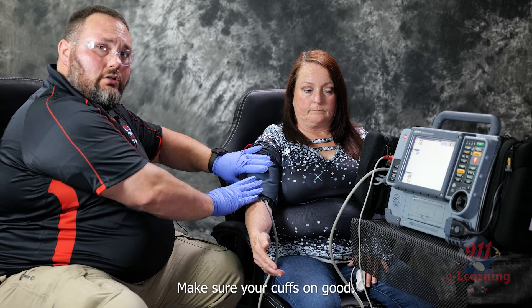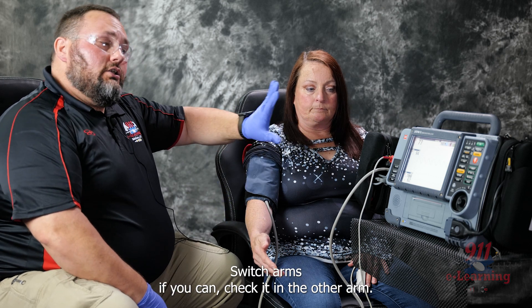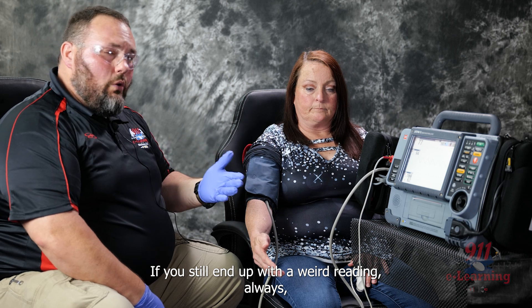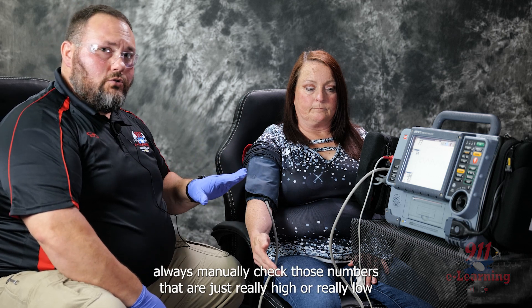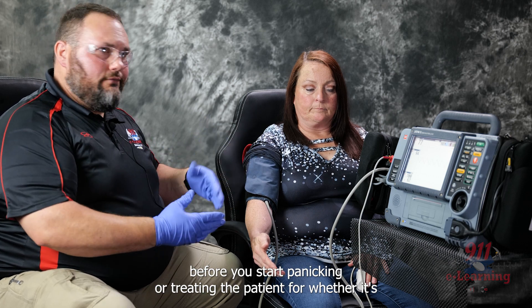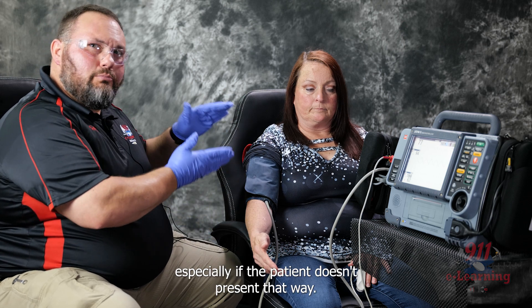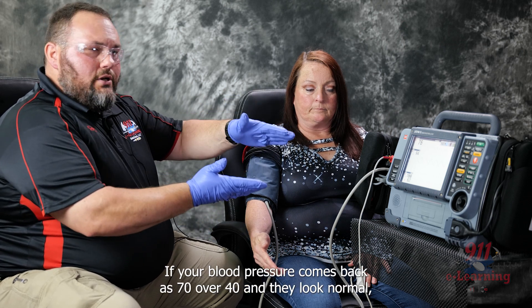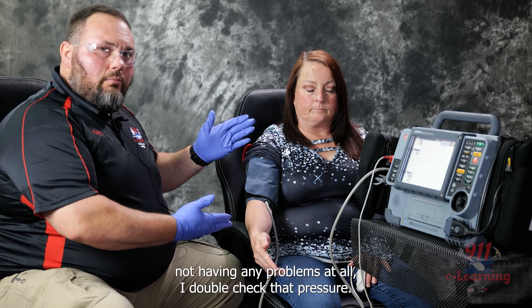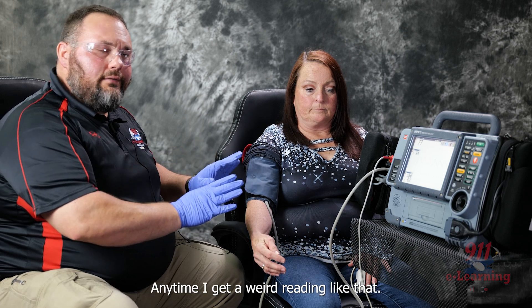Check it again — make sure your cuff is on good and in the right location. Switch arms if you can and check it in the other arm. If you still get a weird reading, always manually check numbers that are really high or really low before you start panicking or treating the patient for hypertension, hypotension, or whatever the case may be. Especially if the patient doesn't present that way — if blood pressure comes back 70 over 40 and they look completely normal, I always go to a manual cuff.